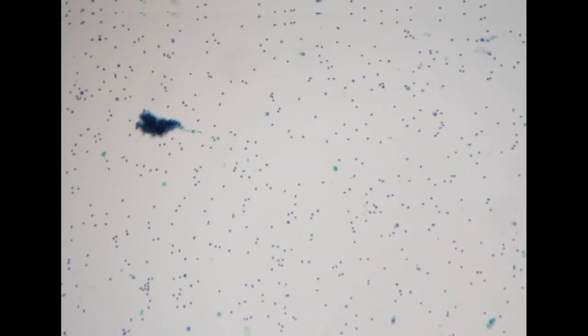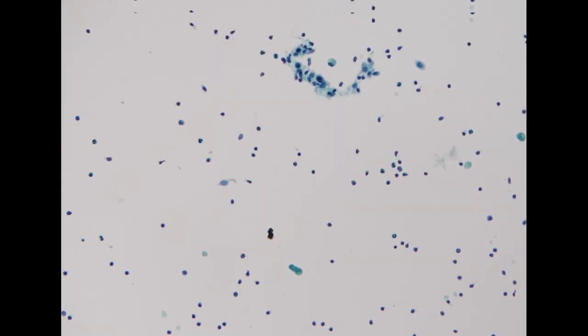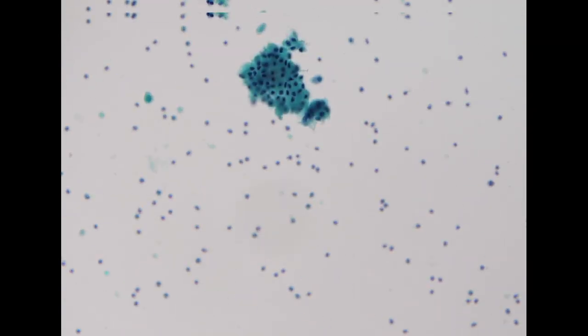So next, let's move to some parotid aspiration. This is coming from a 62-year-old male. This is a liquid-based cytology specimen. In the background, we see cystic degeneration debris along with lymphocytic stroma. This type of stroma is quite common and can be seen in a Warthin tumor.